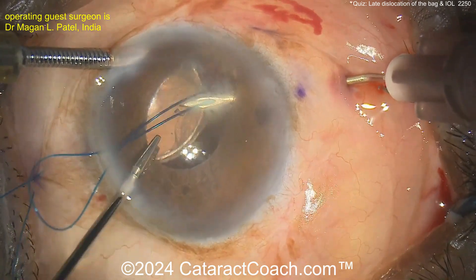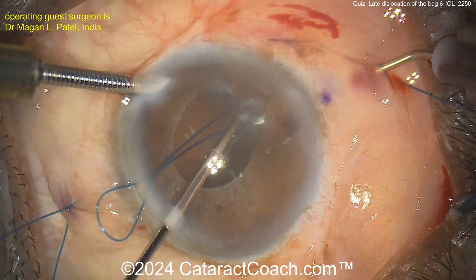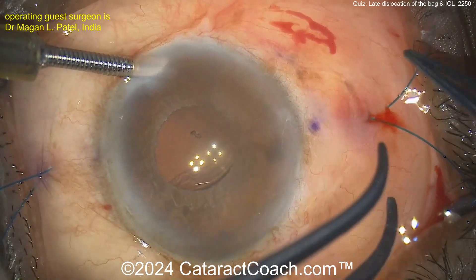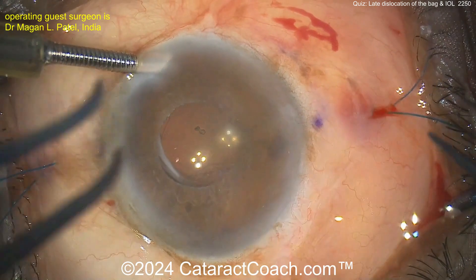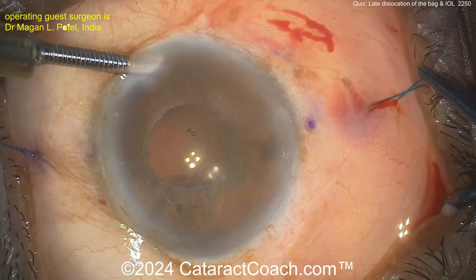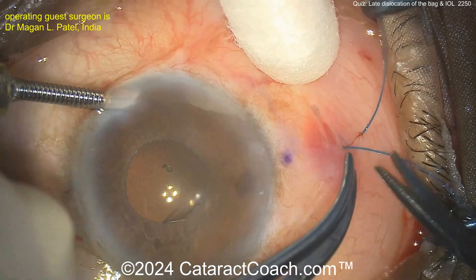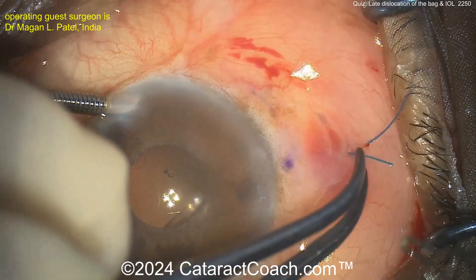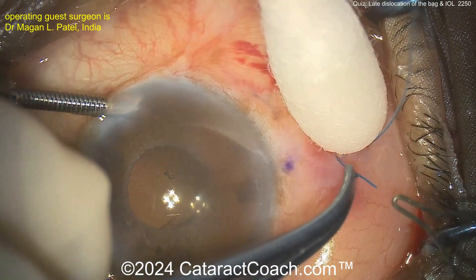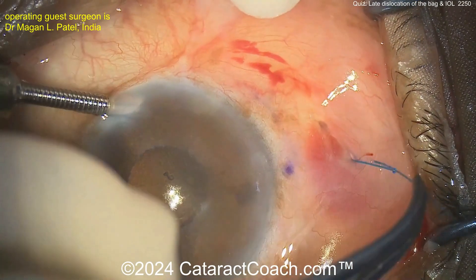It takes me a second — it's to feed it through. I would have just used maybe another incision in the middle and used that left and right, but okay — that works, I get it now. Pulling both sides up, getting the lens centered. Don't pull too tightly because you'll distort the lens and the haptics. A little bit of a flange — that should do it — and pull through that other one.